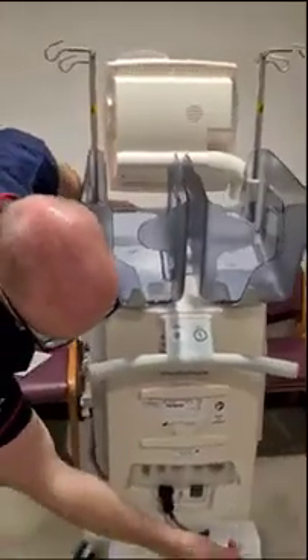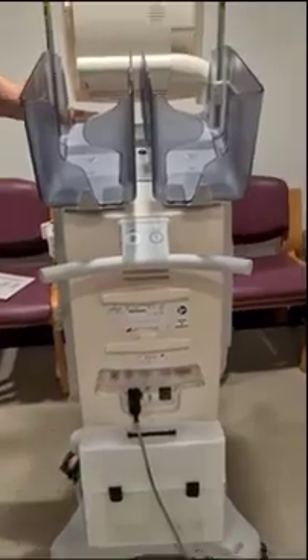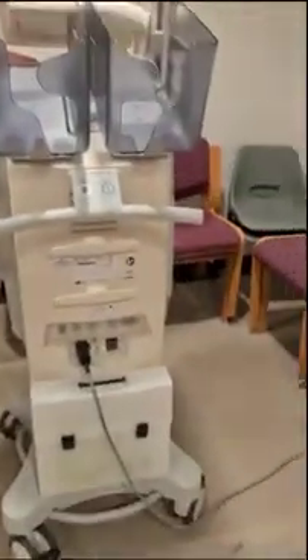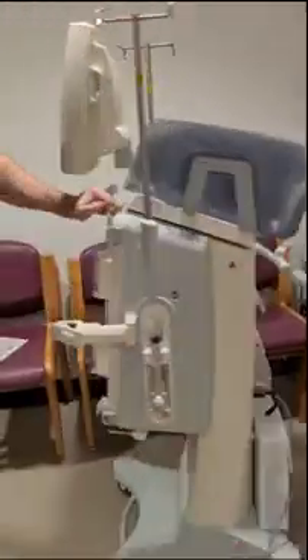Round the back here we have our charging cable. Make sure it's always plugged in and we have it on standby — that way the battery's always charging. The battery lasts for about 15 minutes. That's it.